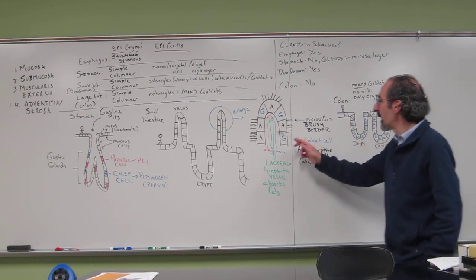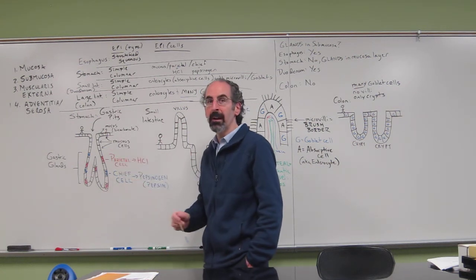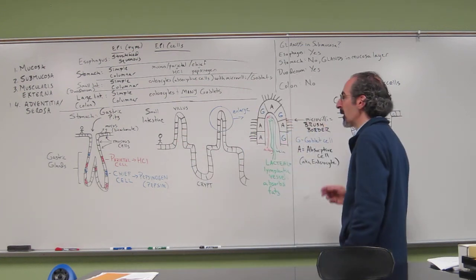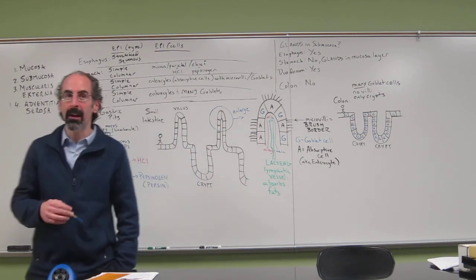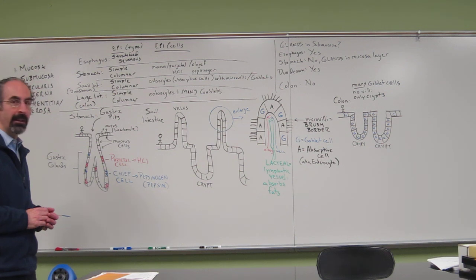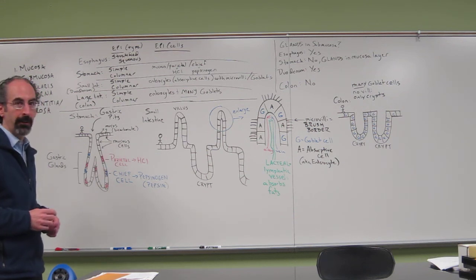Again, the changes in the lining of the epithelium are all meant to be reflective of the different functions that the stomach, the small intestine, and the colon have. That is outlined more in the book. Here I'm just trying to give you a general brief overview in terms of what these features look like and what to keep in mind to help you distinguish one from the other.